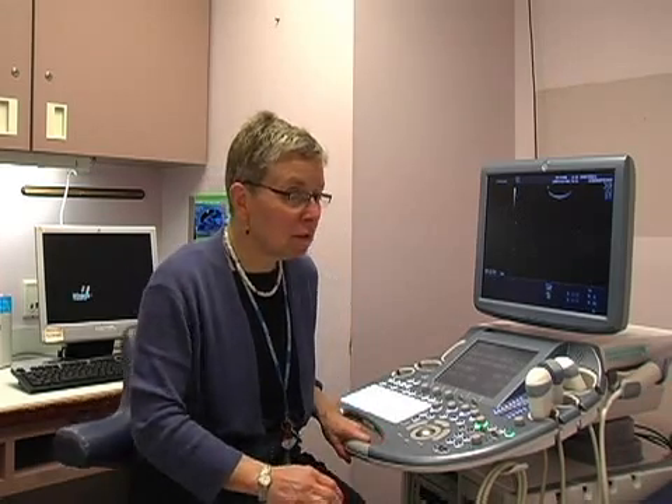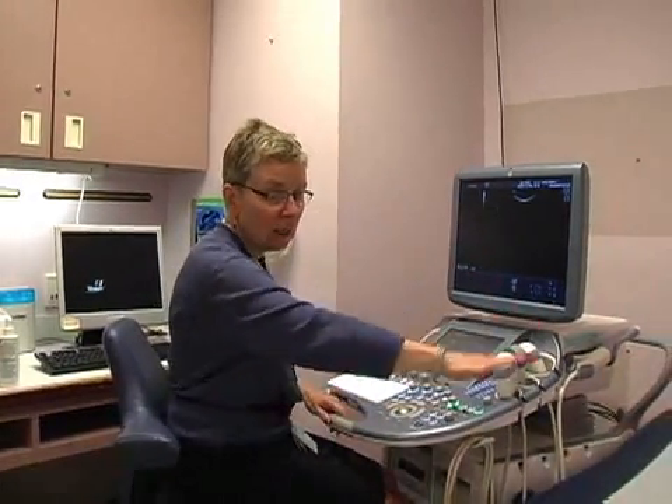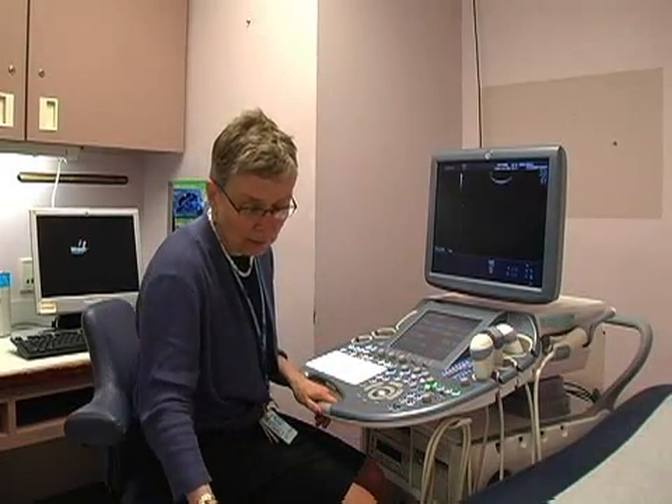When we do obstetric ultrasounds, we sit to the patient's right. As you can see, this is the ultrasound machine and my patient would be lying right here. That's comfortable for us because most people scan with their right hand.